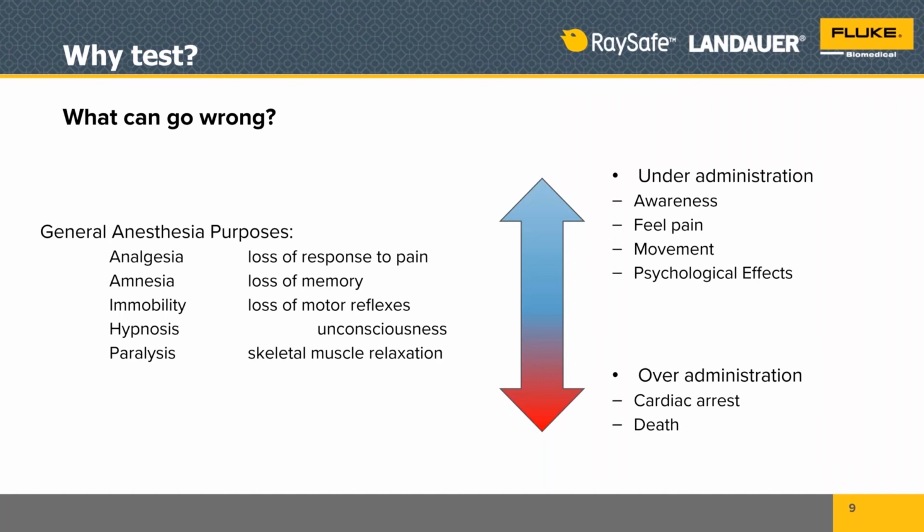But yeah, there are a lot of things that can happen to the patient if you don't get this mix right. Aside from measuring the airway gas and the anesthetic contained therein, the anesthesiologist is also monitoring other physiological parameters, such as uptake of oxygen, SpO2. There are other technologies that measure your awareness, like the bispectral index, the BIS system that's been around for a while. That's one way the anesthesiologist can determine your awareness level. But they're also, like I said, looking at other physiological parameters to determine what state the patient is in as far as awareness.